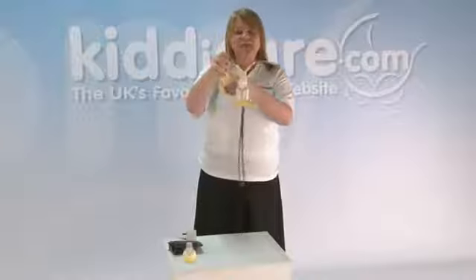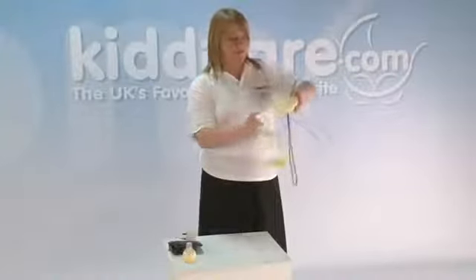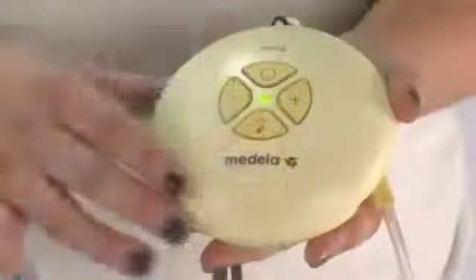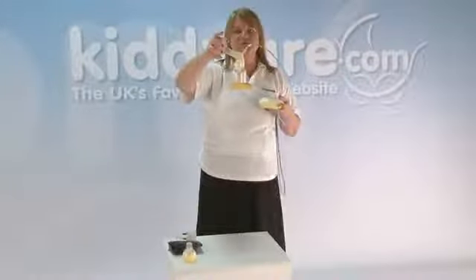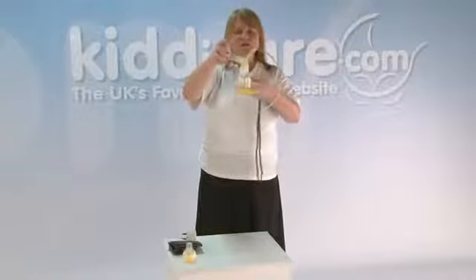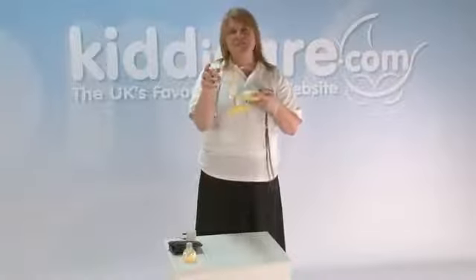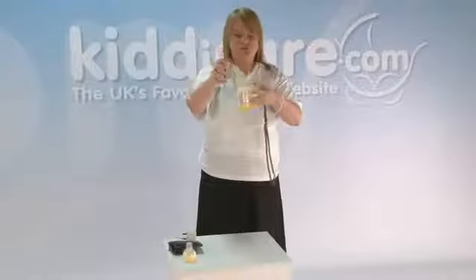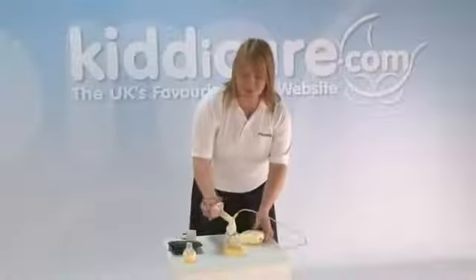If mum starts to see milk appear here before the pump has slowed down, she can slow it down herself just to save a little time. And the way you would do that is by pressing the button with the droplets on it. So if I press that now, you will see that the pump now has slowed down, and that's the expression phase. So that's how the milk will now be transferred from breast into the bottle. What we're looking for when mums express is that the flow slows down after a while and it looks like it's almost stopped. And to mum, the breast feels soft. At that point, give it another minute or so and then turn it off with the on and off at the top there. So that's the two-phase expression.